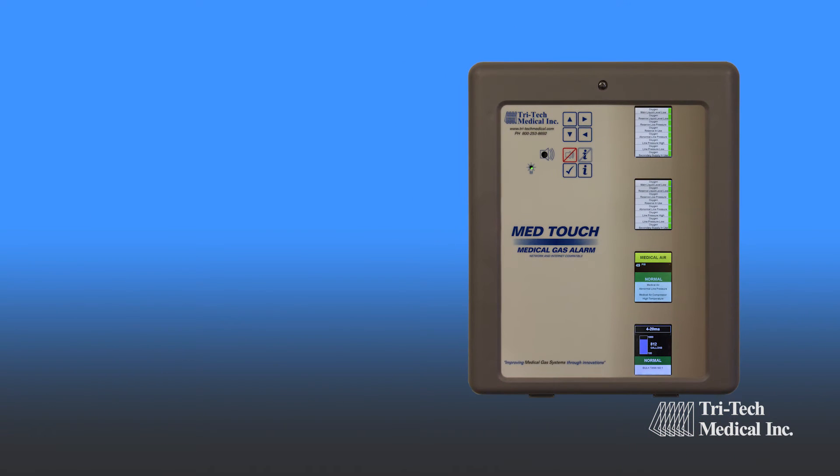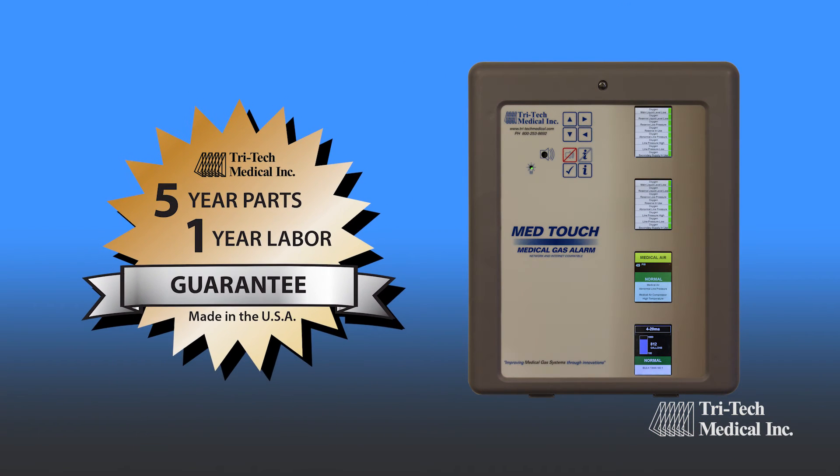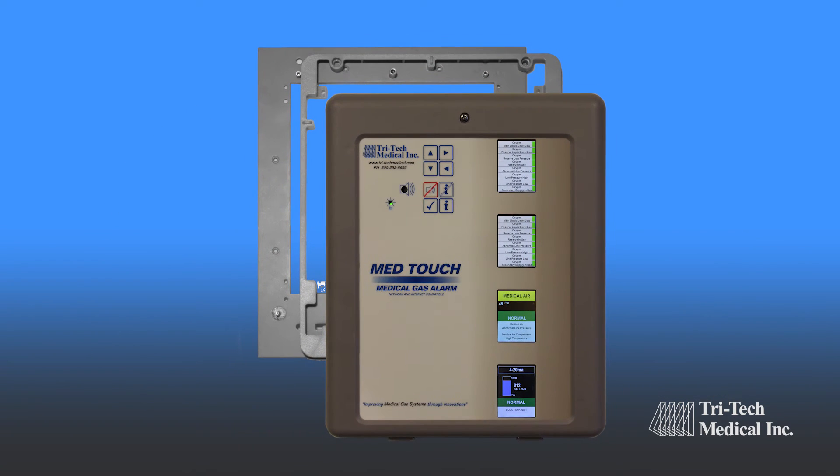The MedTouch alarm is made in the USA, and is backed with a five-year parts and one-year labor warranty, and is available in retrofit form for most older master alarms.